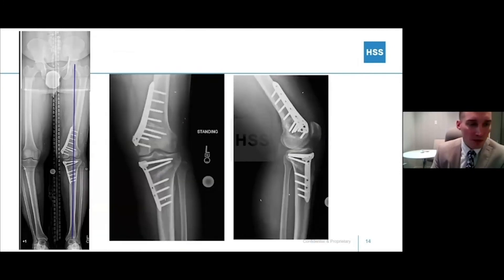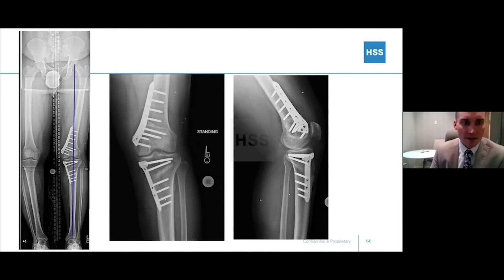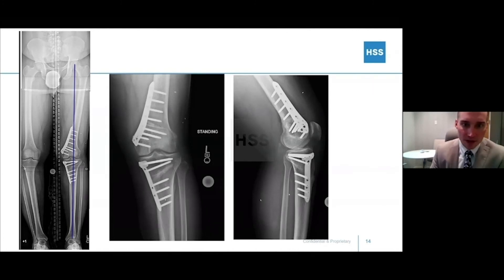In the OR, we see very reasonable-sized wedges stabilized with plates. This was done on the medial side in this patient so that the LCL reconstruction could be performed. We can see the lateral side of his joint has been closed down, and early healing is already visible in the wedges on the lateral view, which ends up being slightly anteromedial.